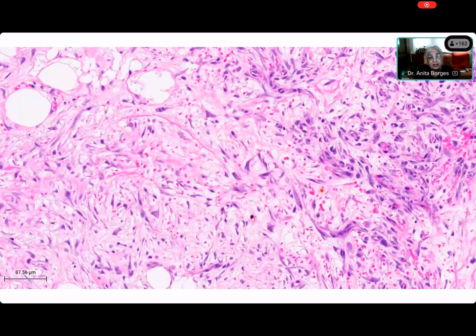Look at the stellate cells. Anybody who has an issue with stellate cells, please note that the cells may have long processes and there are also mitoses, but look at the shape of the nuclei. The shape of the nuclei is very irregular and the cells also have multiple poles to the nuclei. So please, you have to imprint this in your minds as being stellate. There are huge numbers of stellate cells. So what is a stellate cell? Look at them. They're all over the place.